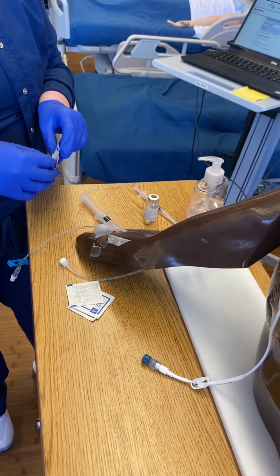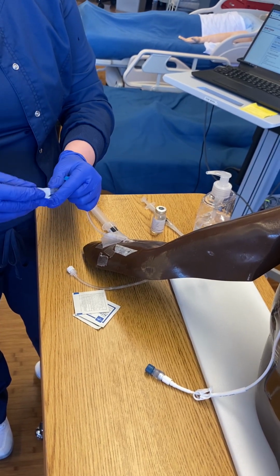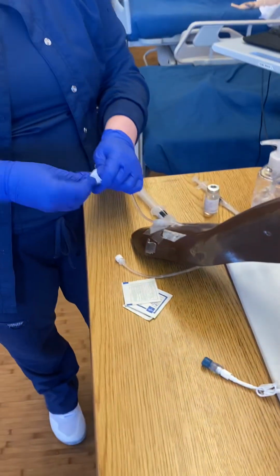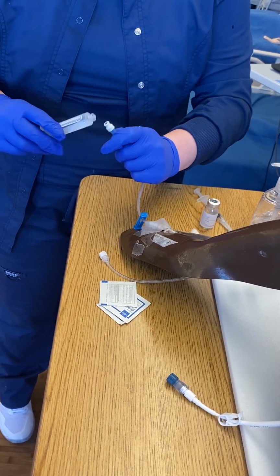So I'm gonna start making sure the lock is off, disinfecting the hub, getting my saline.